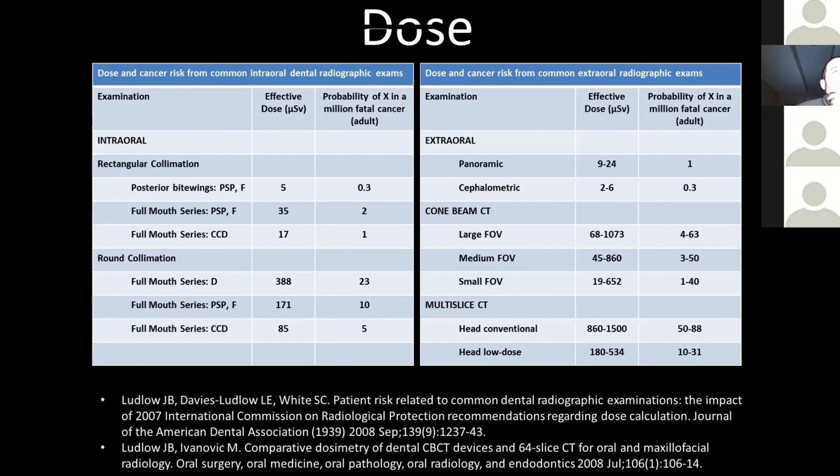All right, when a patient brings in a CT scan from another office, are we able to duplicate that CT scan for our records? Absolutely. And my blunt recommendation would be to just copy the files onto a secured space in whatever kind of network or computer system you have. For the most part, if you can find the DICOM files, or basically something that has one folder with several hundred files or one big file, that's the data itself. And hopefully you have a separate software that might be able to open up and view that.